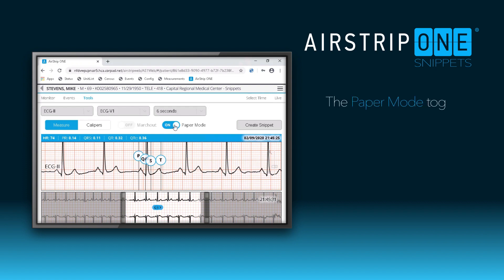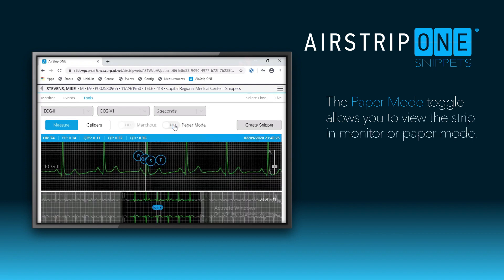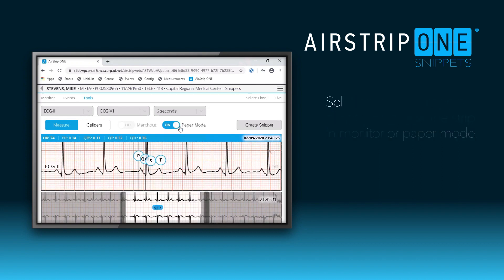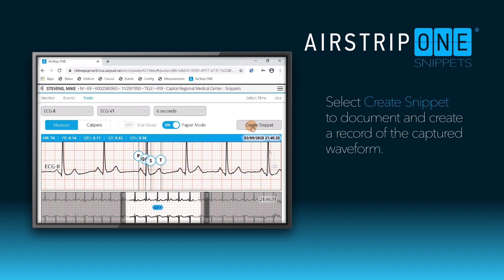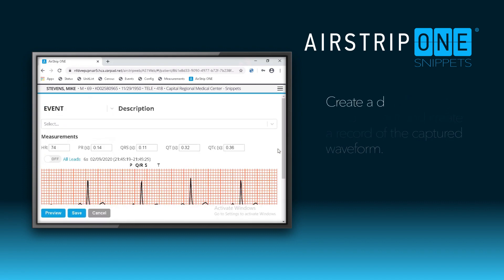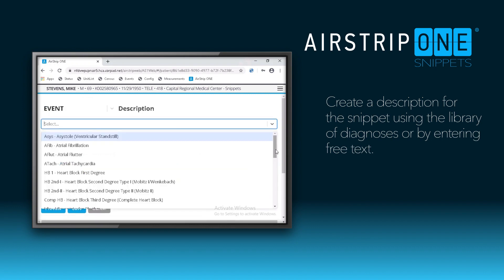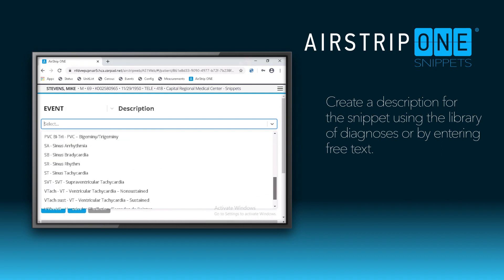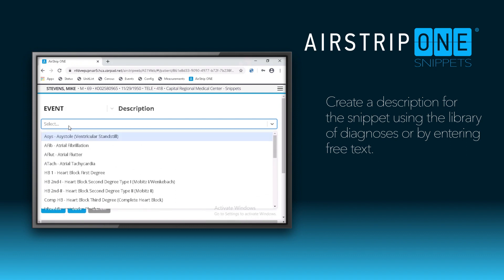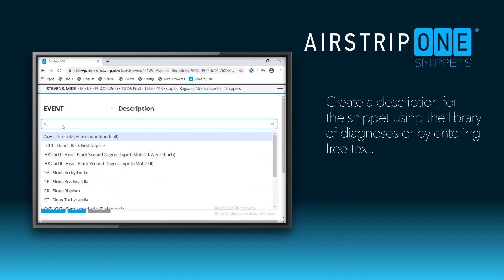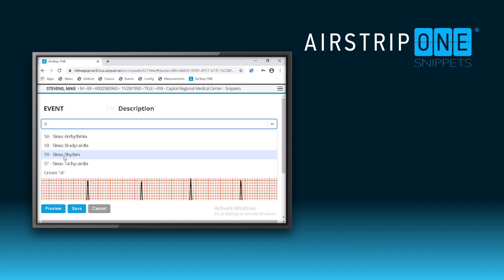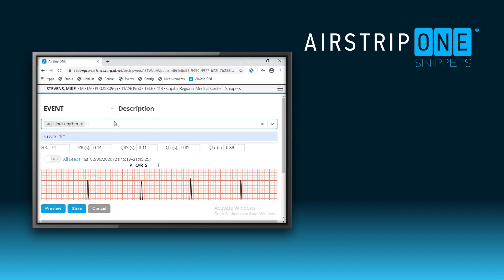You can also change the view between a black monitor mode and a paper mode. The Create Snippets option allows you to create a description for this rhythm. The description can be selected from a library of diagnoses or by entering freeform text, which can include statements regarding medications or other observations the physician may be aware of.